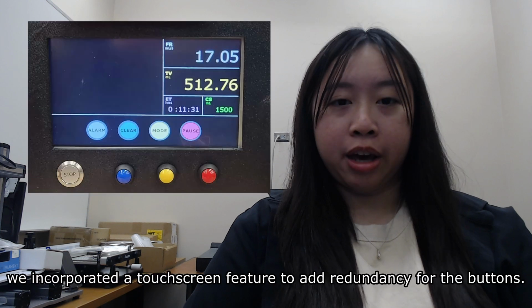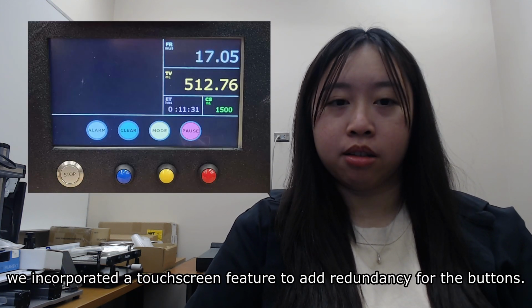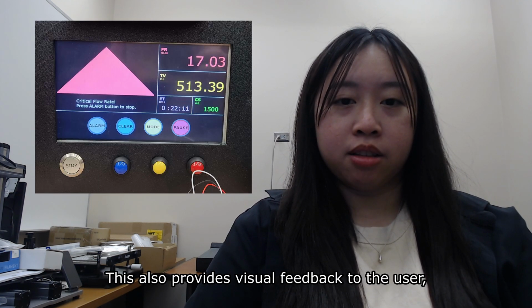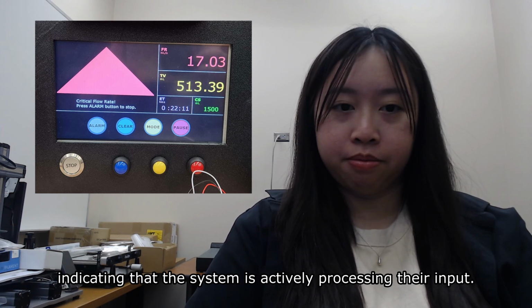From user feedback, we incorporated a touchscreen feature to add redundancy for the buttons. To highlight important information, we adjusted the color of the text. This also provides visual feedback to the user, indicating that the system is actively processing their input.